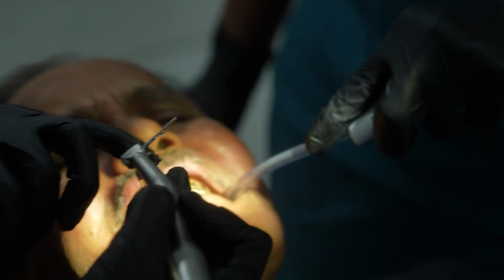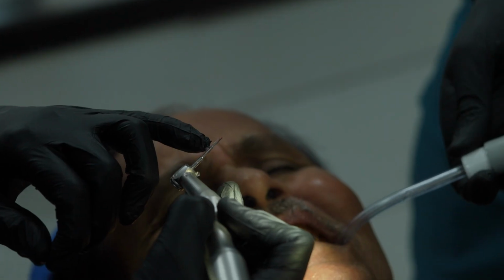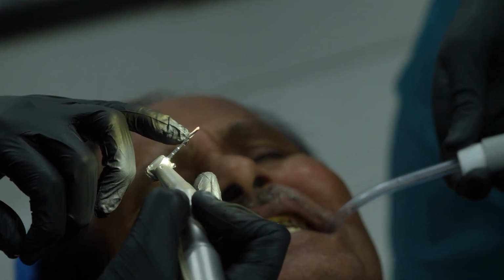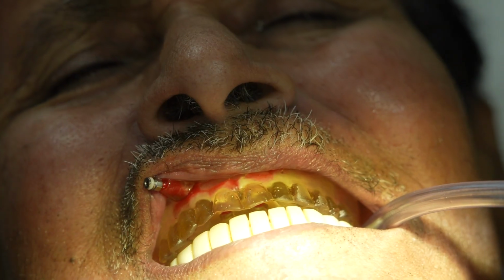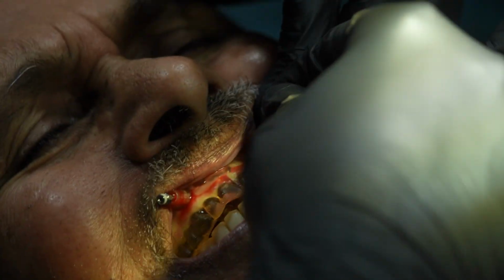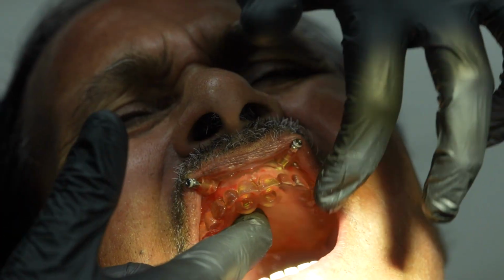This bone suggests that our drill was not in the soft tissue, it was within the bone. We have stabilized the guide.